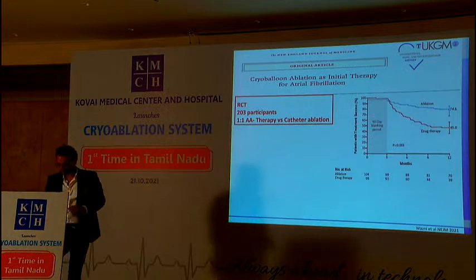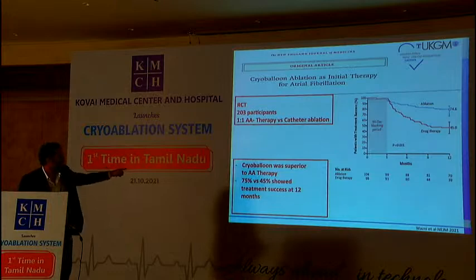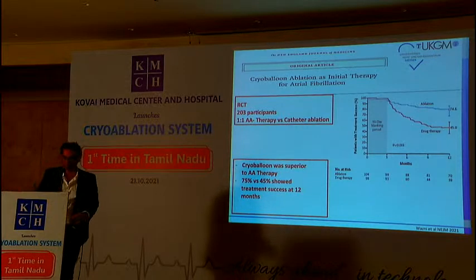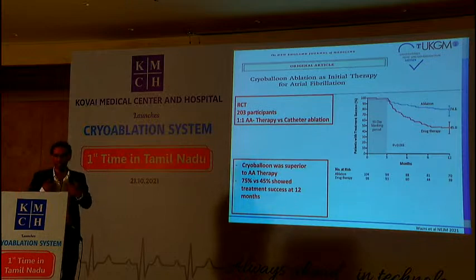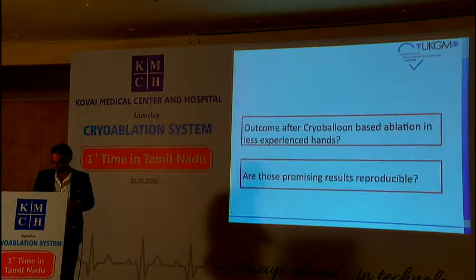As you can see, cryoballoon at long-term follow-up, 1 year, was much more successful than antiarrhythmic therapy, 75 versus 45%. And these patients had an event recorder, a loop recorder implanted. So this is not the very weak Holter or 12-lead ECG follow-up. This was a good, standardized follow-up.